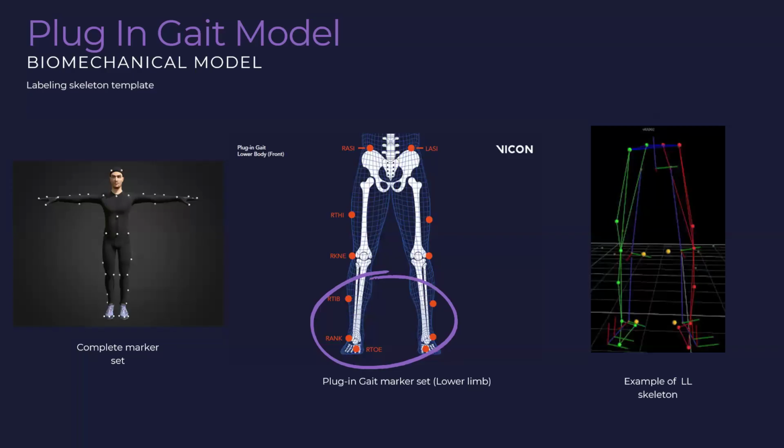The other thing, so you have other modalities you want to measure in your analysis for your specific project with your exoskeleton. And with the Vicon system, how would you synchronize all of that? With the exo? With the exo, yes. Everything will be linked to the Raspberry Pi. So I will do the same thing as now, I think.